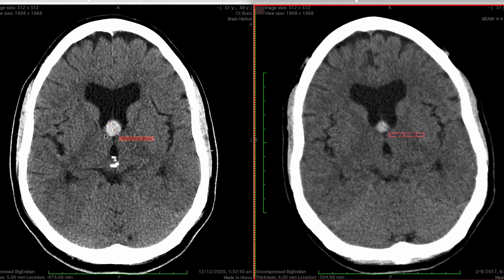So this is a great mini case. There's not a lot of differential diagnosis that has this appearance, so you can be confident when you see this appearance to call it a colloid cyst of the third ventricle.